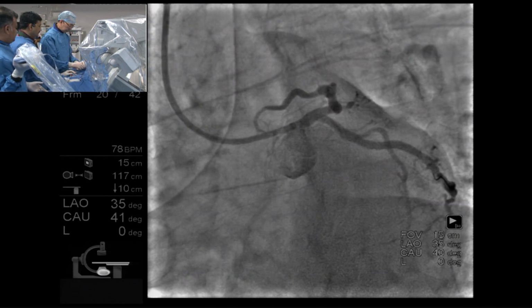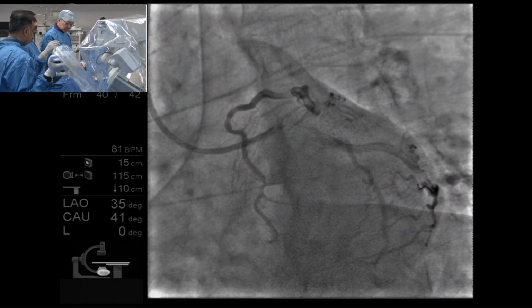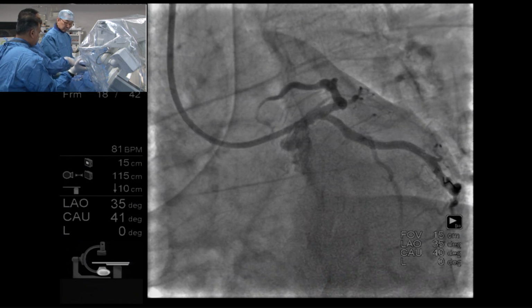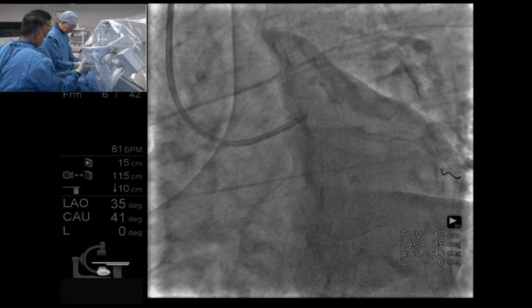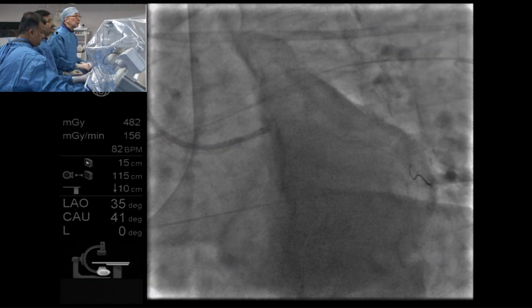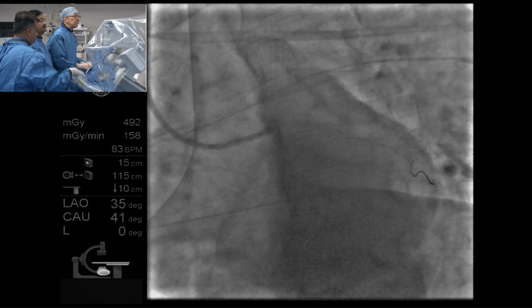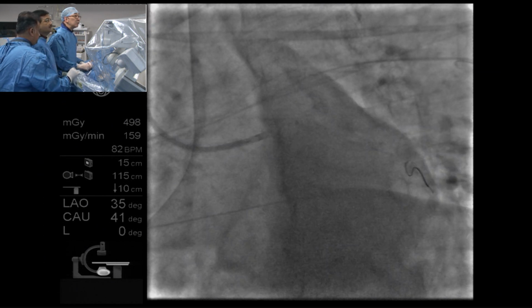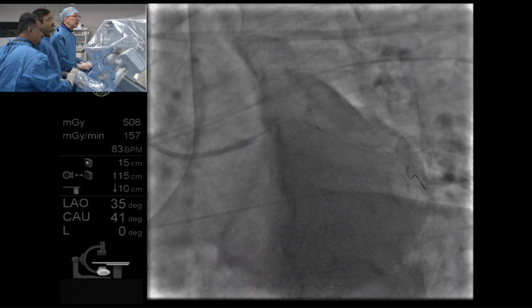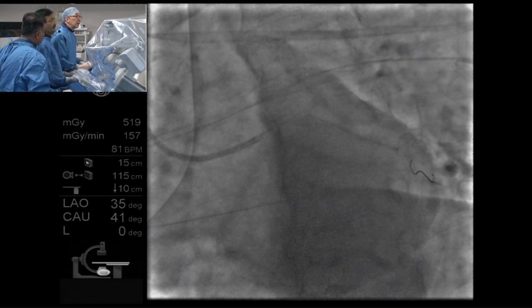It's always a bad combination to have a left main calcium, circumflex lesion, and tortuosity. You always have that danger of dissecting the left main. We always have to keep an eye on the ostium. So we really need to be very careful when we get the catheter in and out, especially when you pull out the balloon and the guiding catheter. You don't want something to happen.